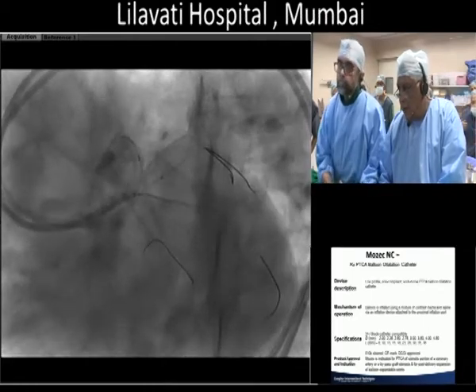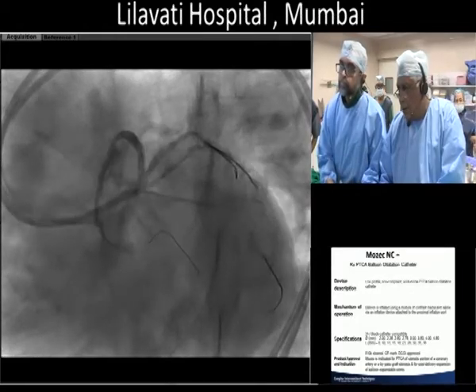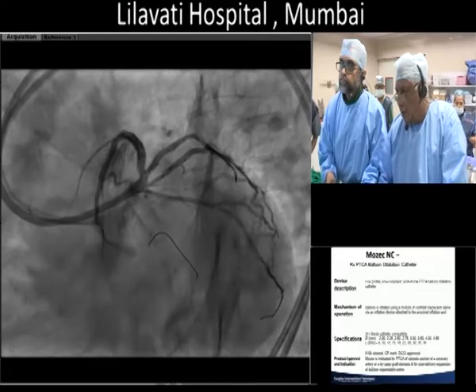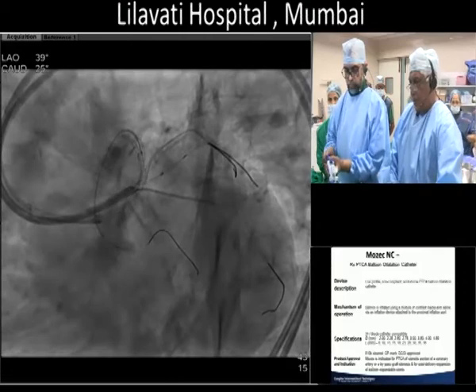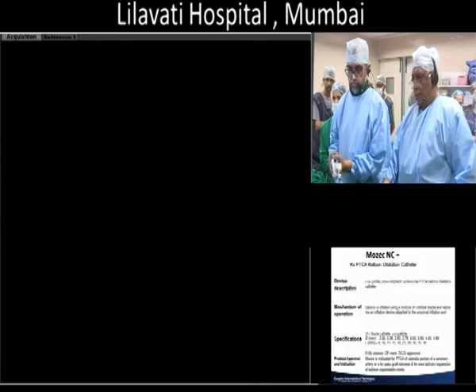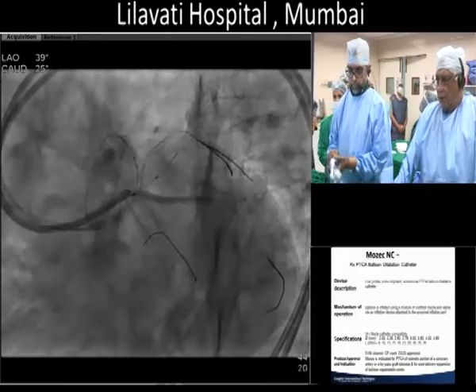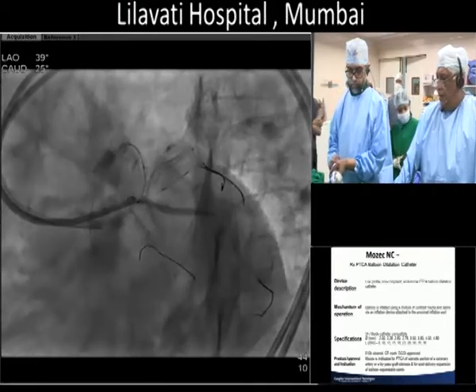Okay. Go up on the stent. So, beautiful demonstration. He's not jailing the distal circumflex. He's got both other branches secure. He's making sure the origin of the circumflex is covered by stent. And he has control of all vessels.